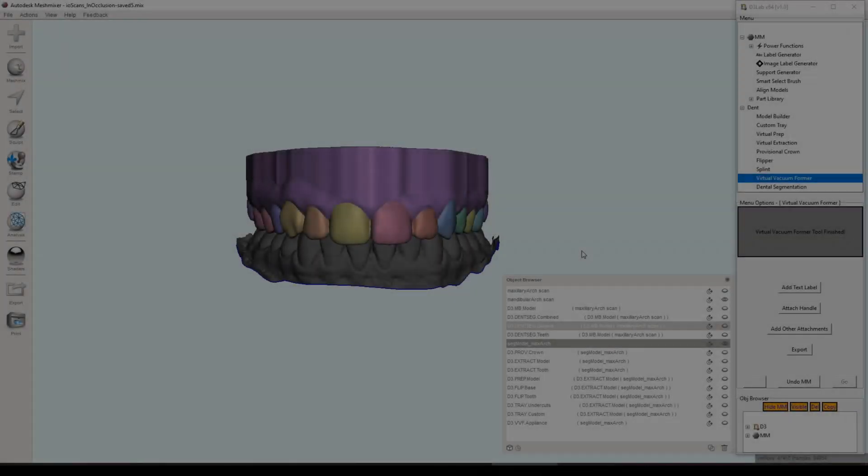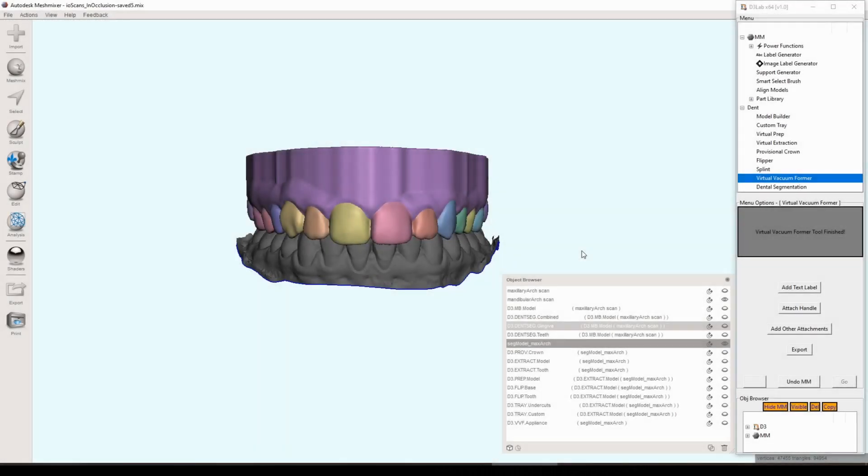Welcome back everybody to another installment in the d3lab x64 video playlist. This video is going to be focused on the image and text label generators and the 3D print support generator, as well as quickly circling back to the model builder just for a couple additional notes.